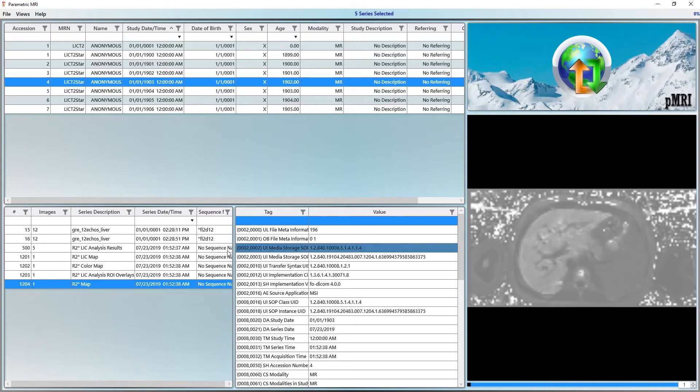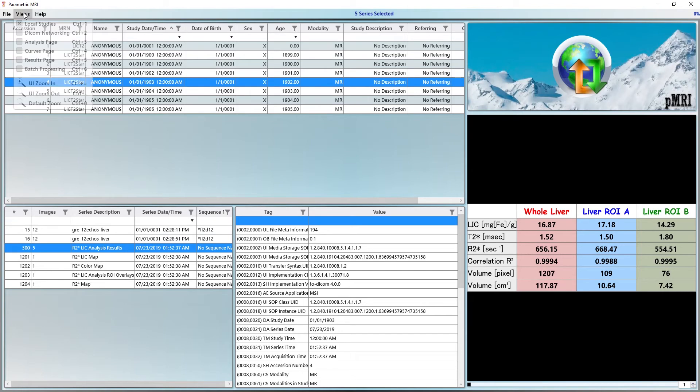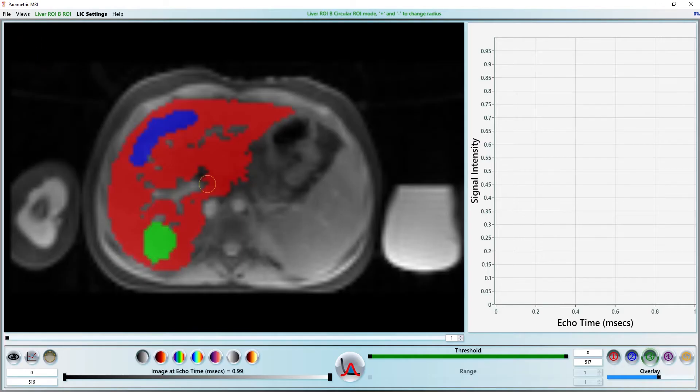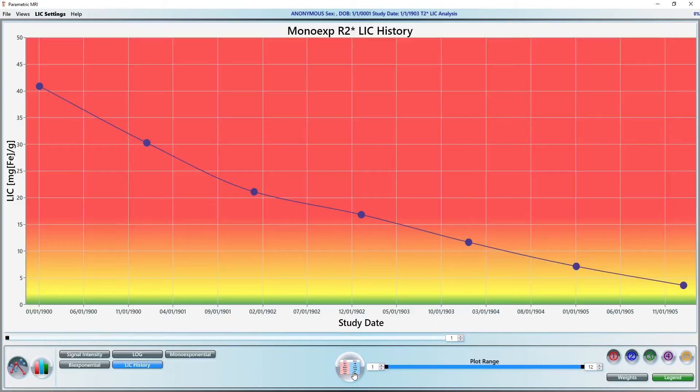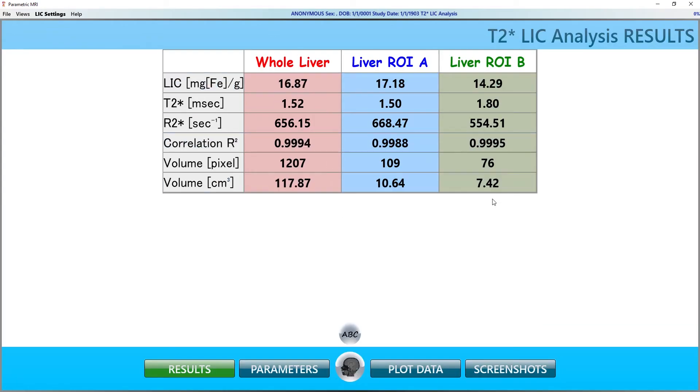First, let's get back to our analysis by selecting Views, Analysis Page or pressing CTRL-3 on the keyboard. Now let's go to the tabulated results by pressing the Page Navigation button twice or pressing CTRL-5 on the keyboard. The three columns of numbers correspond to the ROIs we defined earlier in the video.